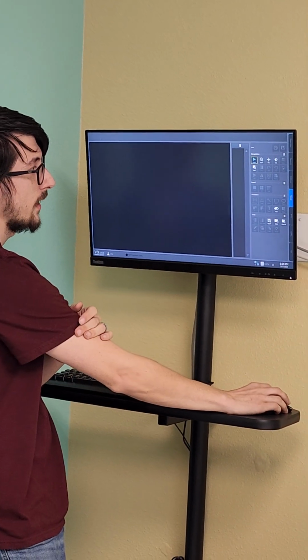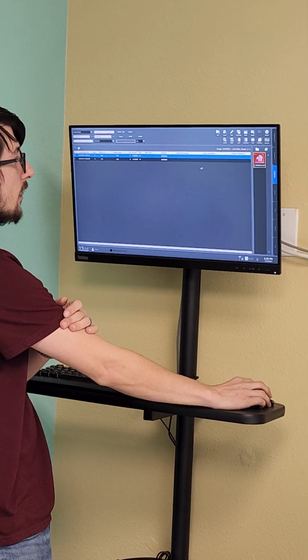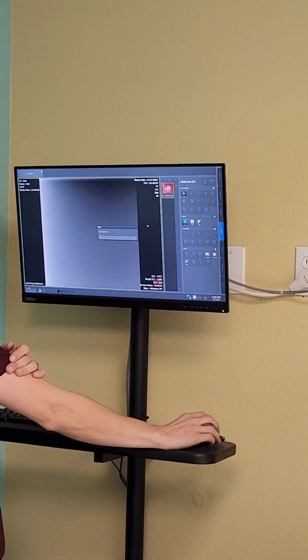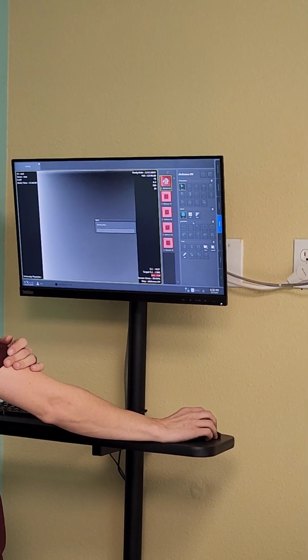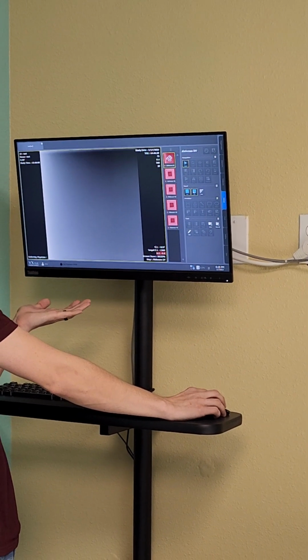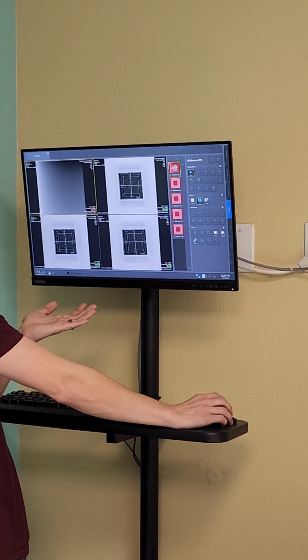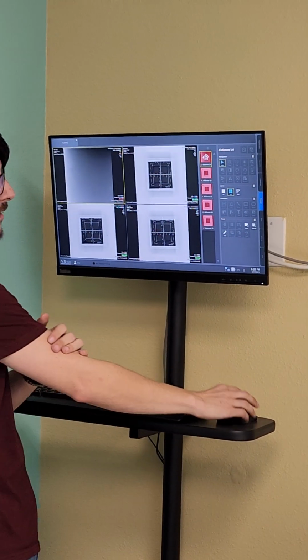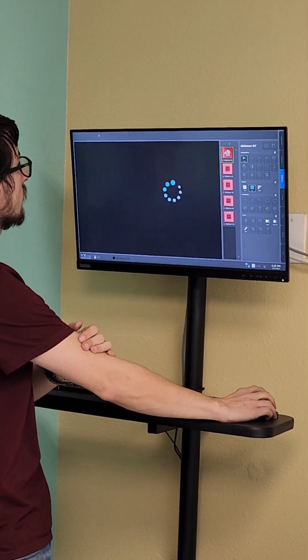Viewer is where you can view studies. So if we go back to the database and click on our images down here, or our study, it'll bring it up in the viewer tab, and we can change everything that we want. And if you wanted to view multiple side by side, you can click these layout tabs and you can view different ones at the same time. And you can just close it up at the top.